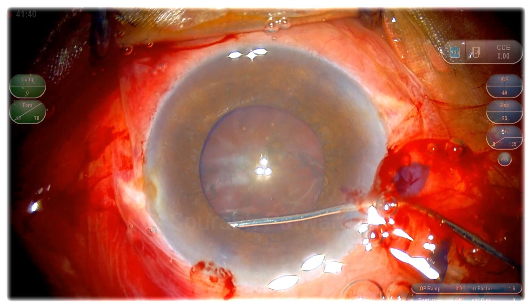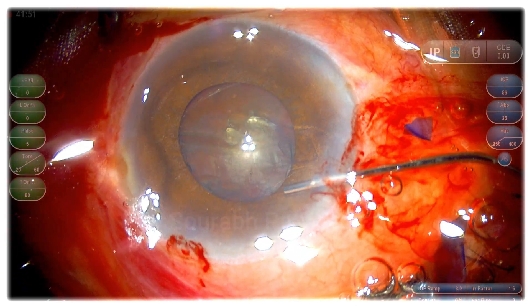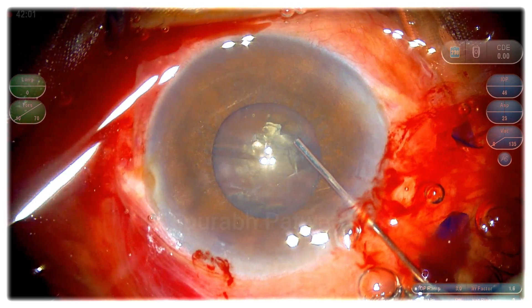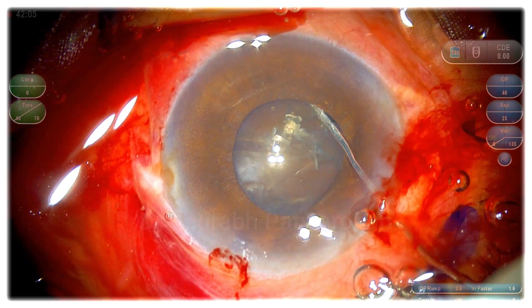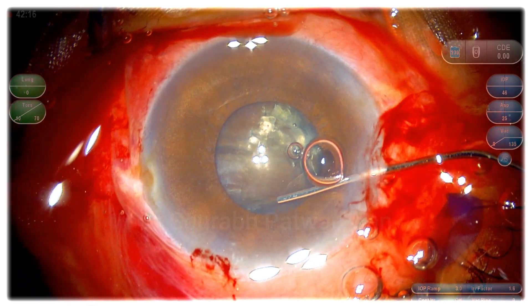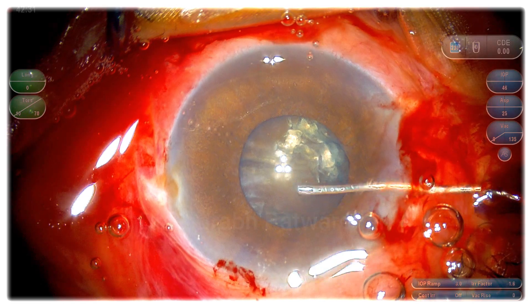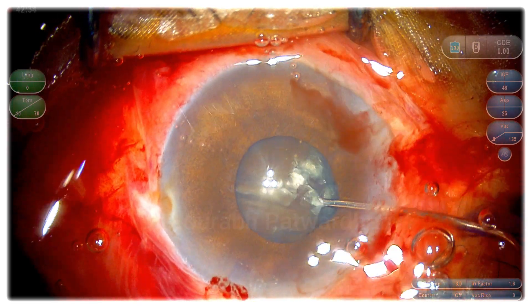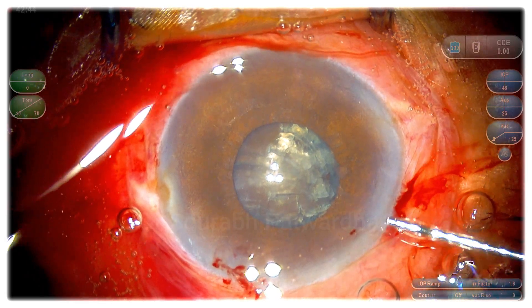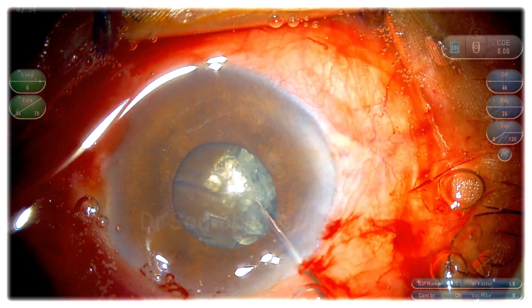Here is the trick: you need to do very controlled hydrodissection. Give minor small fluid bursts — just a little bit — so that you don't get a posterior capsular rupture or hydro-rupture, but you still get a good rotating nucleus. I have not seen that little anterior movement of the nucleus yet, so I am continuing to do a little more hydrodissection, going multiple times in all quadrants giving little pushes of fluid. It is not like the usual push of fluid where I tend to push a lot in softer grade cataract. I check whether I can rotate the nucleus — I couldn't — so again I am giving a little amount of fluid. This is a very critical stage for these dense cataracts; I need to separate it from the capsule.